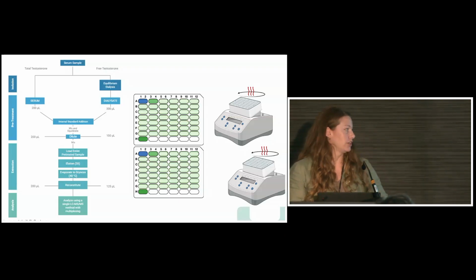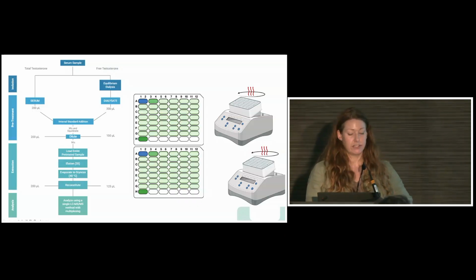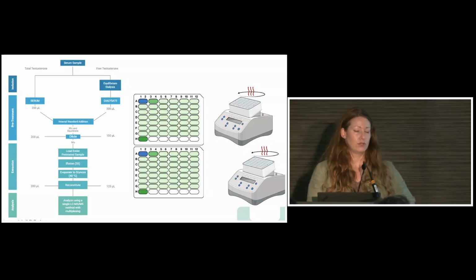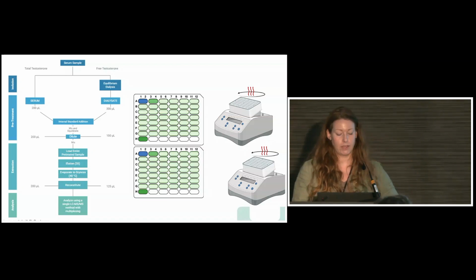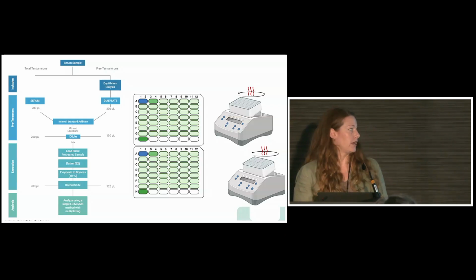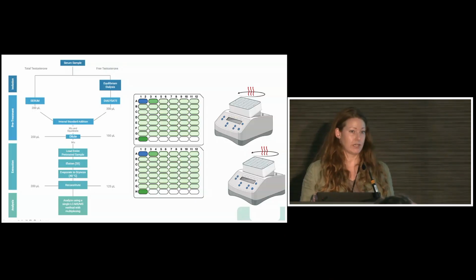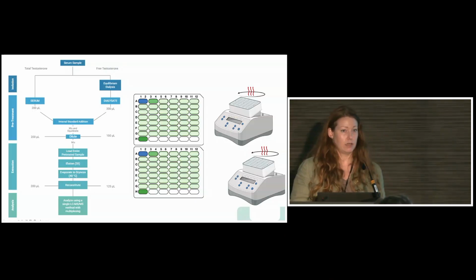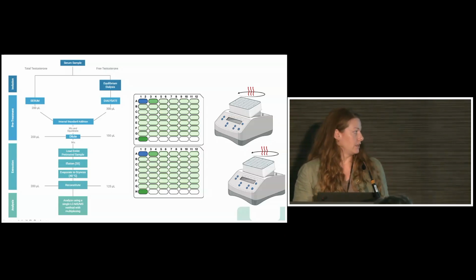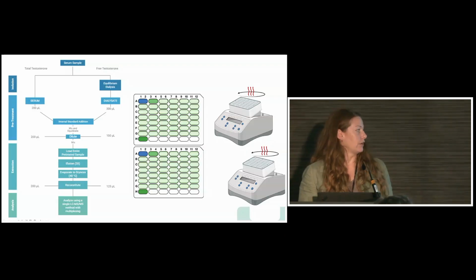Another consideration is the format of the dialysis device. A lot of the vendors will offer single-use devices. You can use a plate. They can have plates with inserts. This is a 48-well format. So if you're running 100 samples, you're going to need to put up 2 dialysis plates. So that's double the blanks, double the QCs. And this is our standard plate format that we have now in the lab.